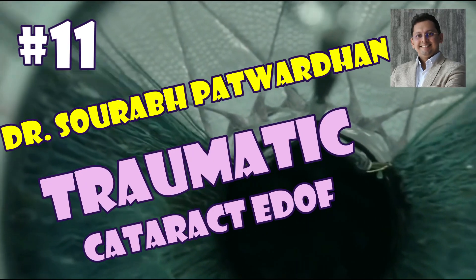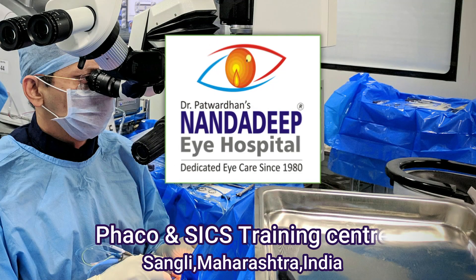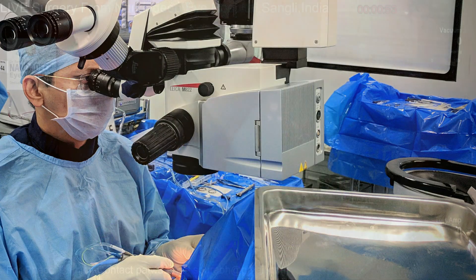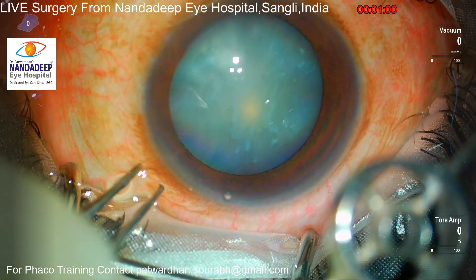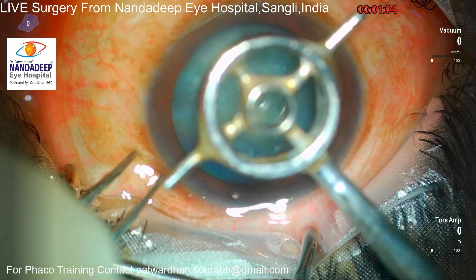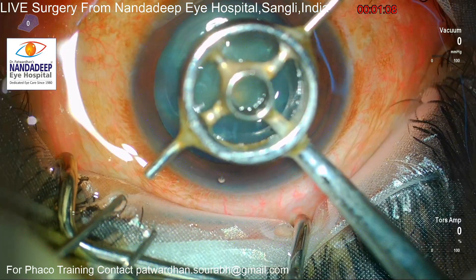Hello friends, this is Dr. Saurabh Patwardhan from Nandadeep Eye Hospital and phaco training centers in India. In this commented video I will be speaking about a traumatic cataract. This is a case of a young gentleman around 45 to 50 years of age who has suffered trauma in this eye around 15 years back.